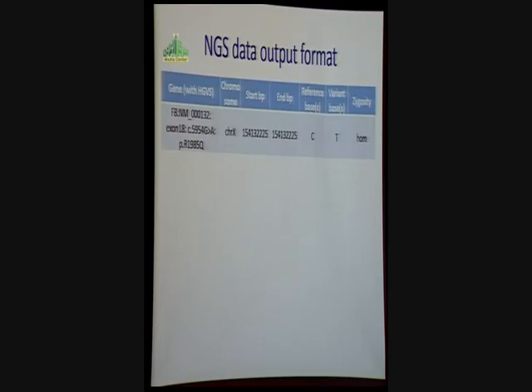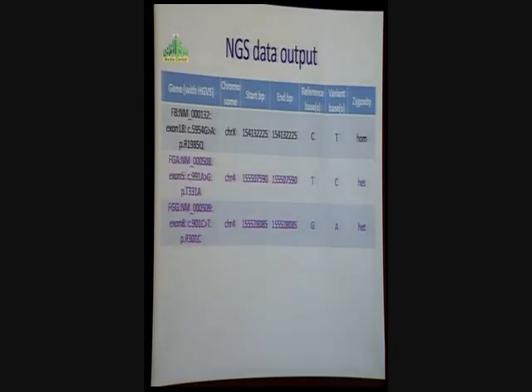So the top example on here shows a patient with haemophilia. We've got the defect in the factor VIII gene. It gives us the reference sequence, the exon, the nucleotide, and the amino acid substitution. It shows the genomic location for that variant, and the original and the variant nucleotide. And these further examples just show an individual that we analysed for a fibrinogen disorder, and the variants identified, with the lower one being a common pathogenic variant.